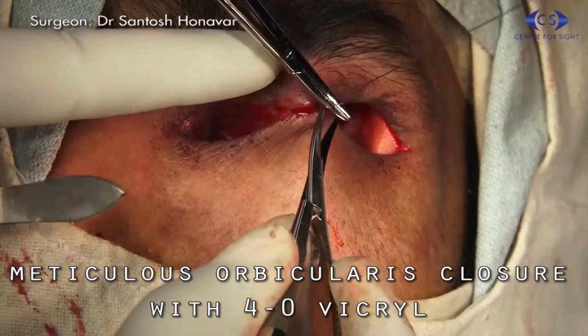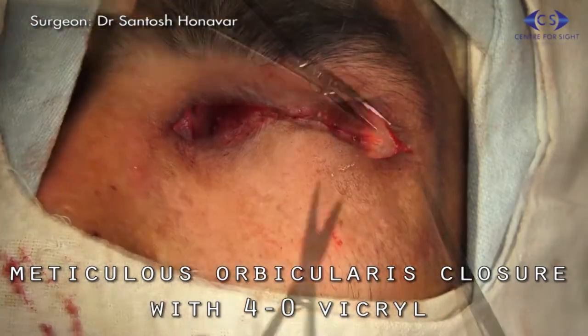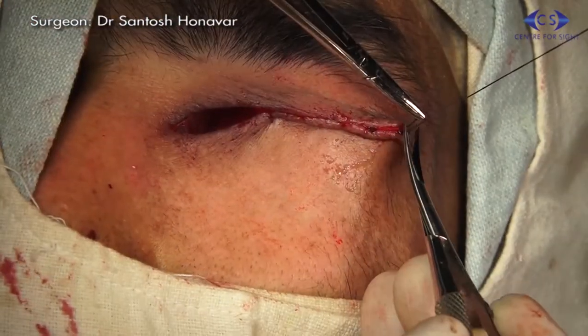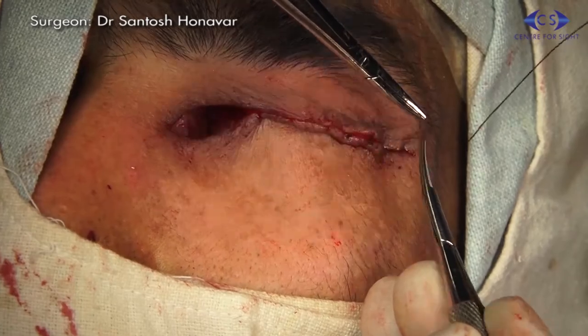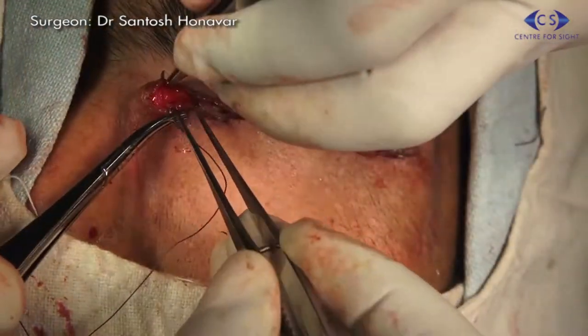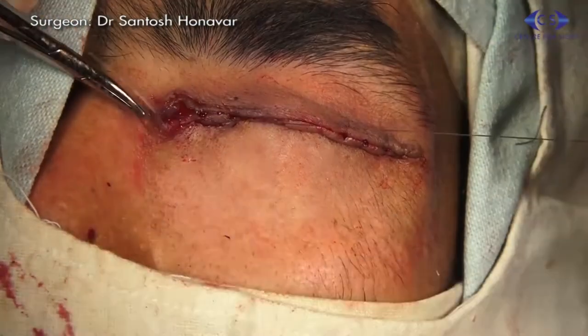The eyelid flaps are re-approximated in two layers. The orbicularis is closed using 4-0 Vicryl and the skin using 6-0 silk.